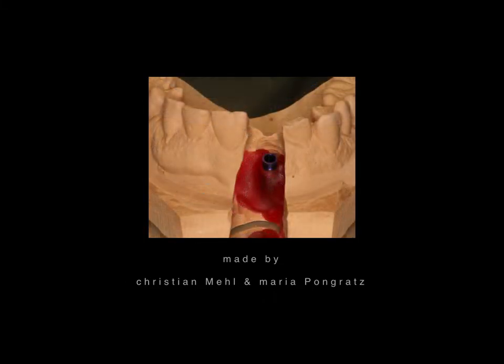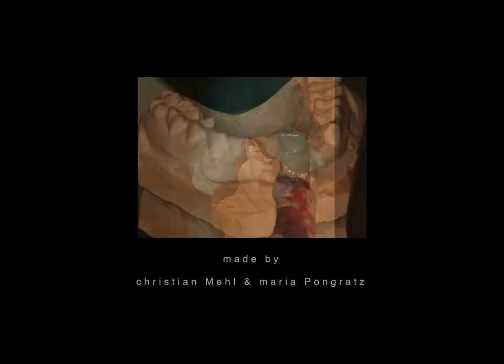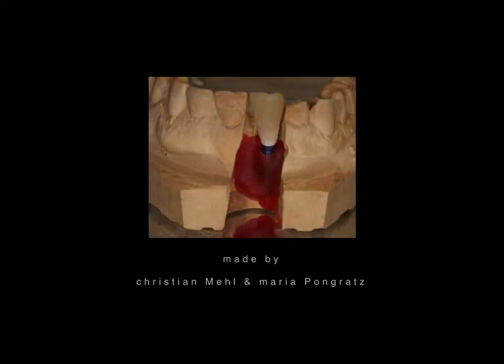The implant position is transferred to the model. The implant analog is fixed with pattern resin in this case, and a PEEK abutment is placed onto the implant analog, and this splint is used to shorten the temporary abutment, and then we just use temporary crown material to produce a temporary. This is the final temporary before glazing.